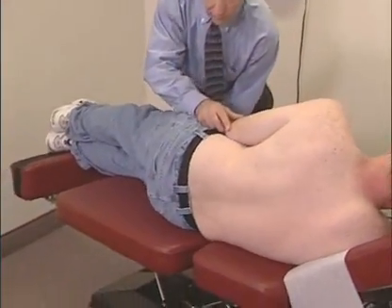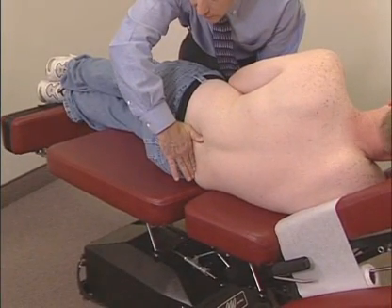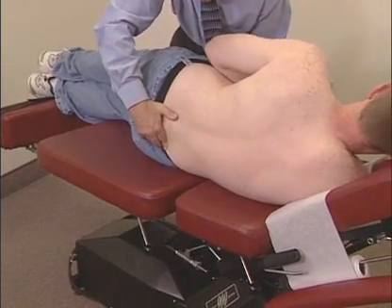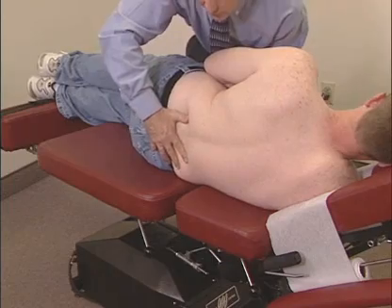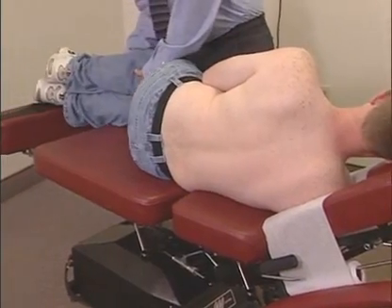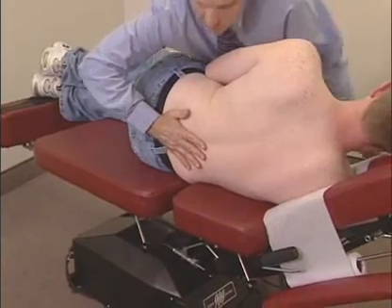When treating an L5 herniated disc, position the patient with the top of the sacrum even with the top edge of the pelvic cushion, leaving the L5 disc space free to move. If the patient had an L4 disc herniation, move the patient down so the top of the L5 vertebra is at the top edge of the table, leaving the L4 disc free to move. Bend the patient's knees up approximately 25% to decompress the L5 disc and facet joints.